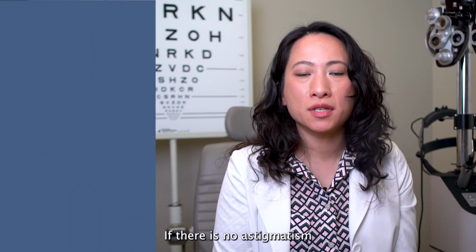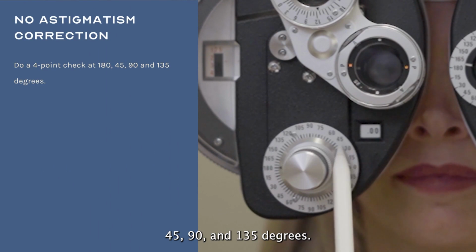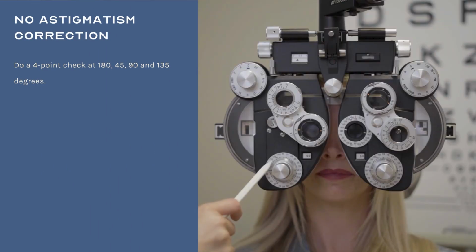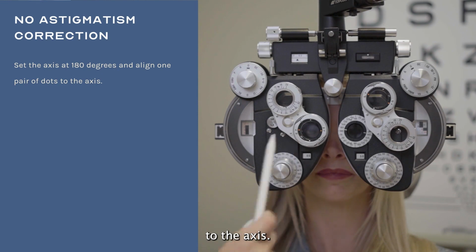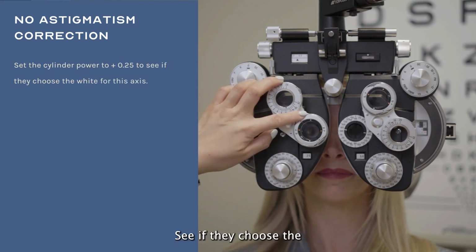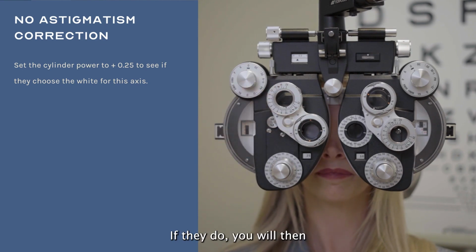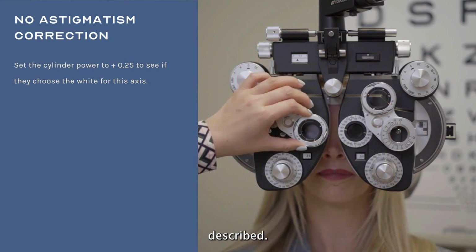If there is no astigmatism correction in your starting point, do a 4-point check at 180, 45, 90, and 135 degrees. Set the axis at 180 degrees and align 1 pair of dots to the axis. Set the cyl power to plus 0.25. See if they choose the white for this axis. If they do, you will then proceed to checking the precise axis as previously described.